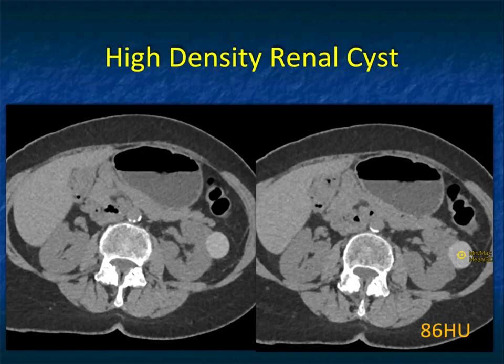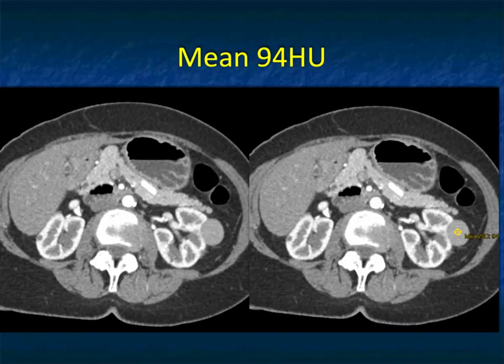One of the problems is a high-density renal cyst. If you look at this case, you see a mass in the left kidney. It was a non-contrast scan. The mass on the left kidney is well-defined at 86 Hounsfield units. If you gave IV contrast — this was not done specifically for the kidney — the attenuation of the lesion really doesn't change. It remains about 94, which is less than 10 change, so it's really not enhancing.